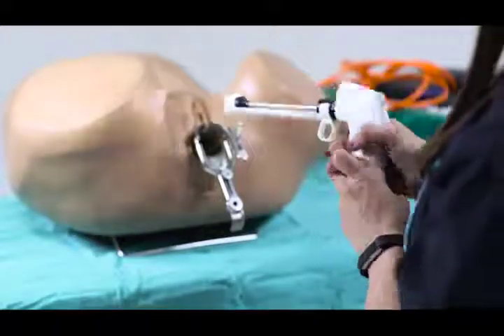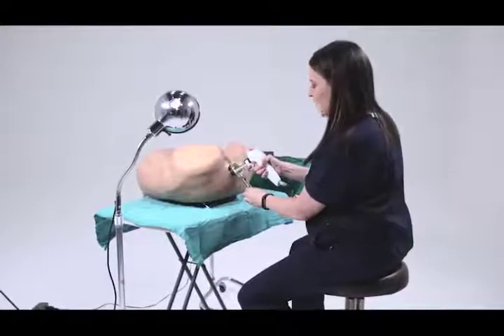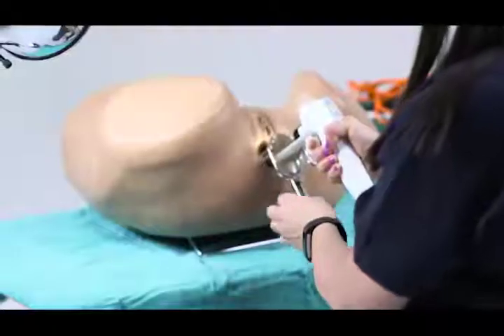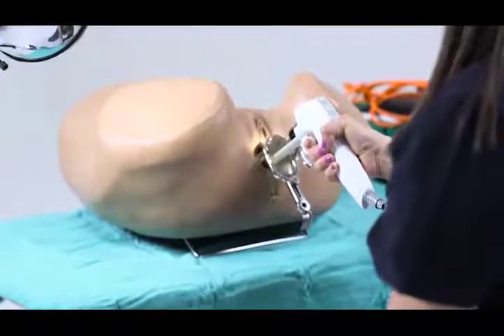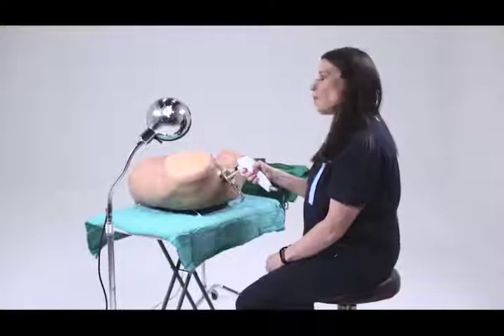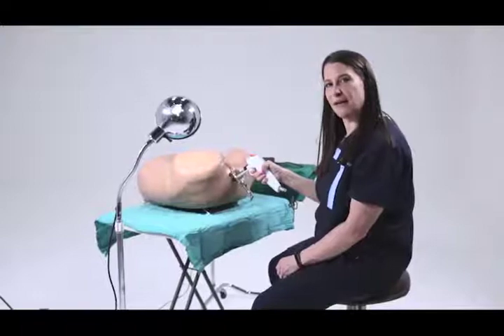When it's ready, you place the probe onto the cervix and then you slide the slider back so that the probe connects with the cervix. Next, you turn on the timer to start and the application should be for 40 seconds. Our recommendation is to treat the patient at 100 degrees for 40 seconds.